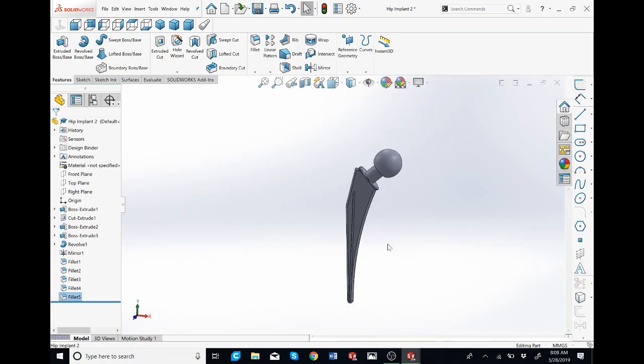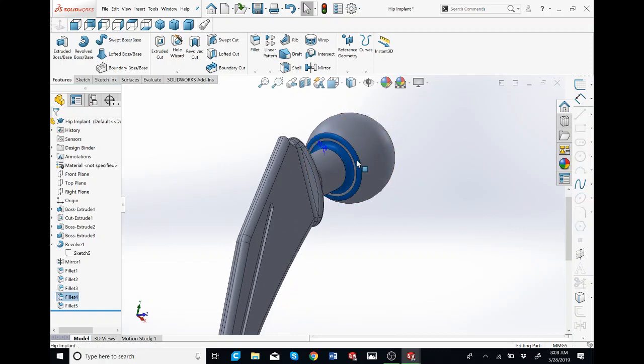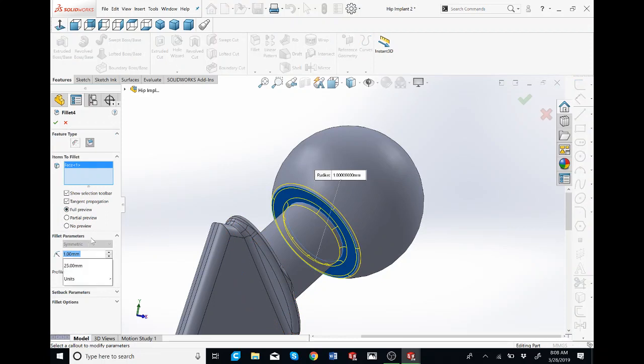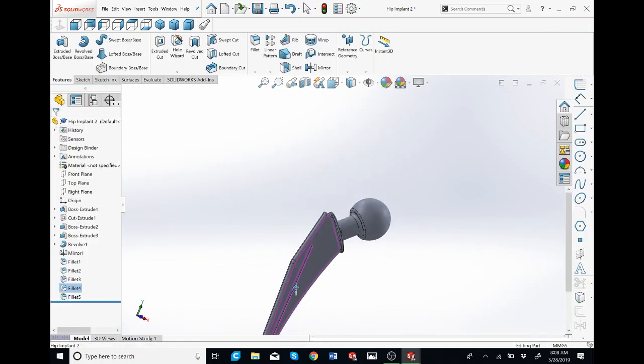And that's the hip implant. So I want to see something real quick. This is 2. So for this one, I believe I put this as 1 when it should be 2. So I'll just edit it to 2, just make it exactly the same way I had before. And that's the hip implant.